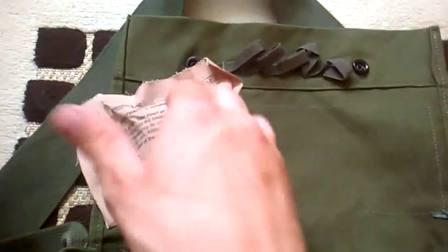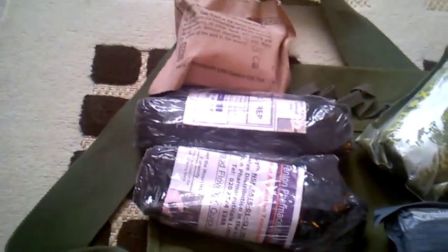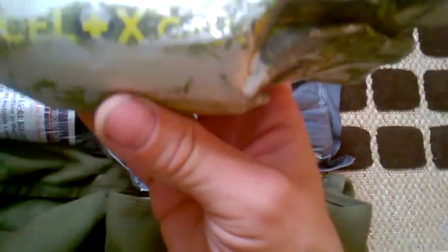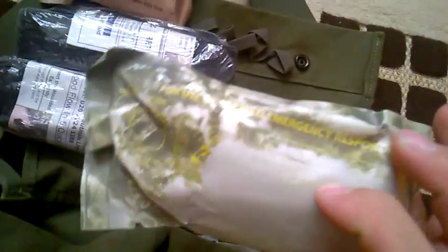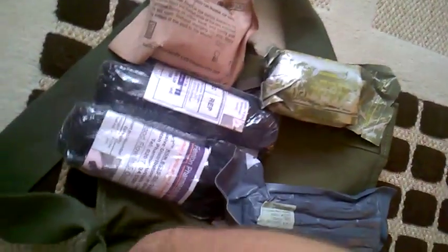You've got the ever-famous shell dressing — it's the joint operations one, so French on one side, English on the other. Then we've got two combat application tourniquets, still new in packaging. One Israeli bandage, and one — as you can see it's got quite a worn foil wrapper — it's the Celox, essentially like the shell dressing but with a clotting additive in it.